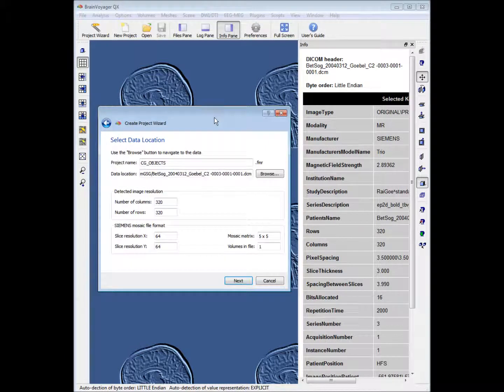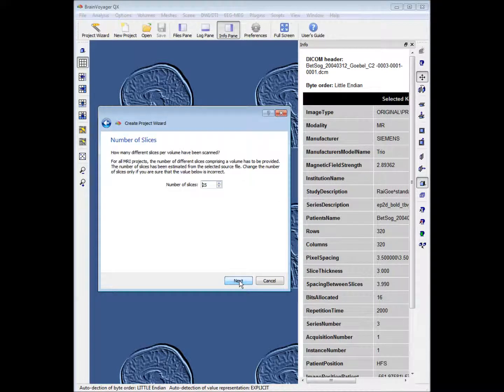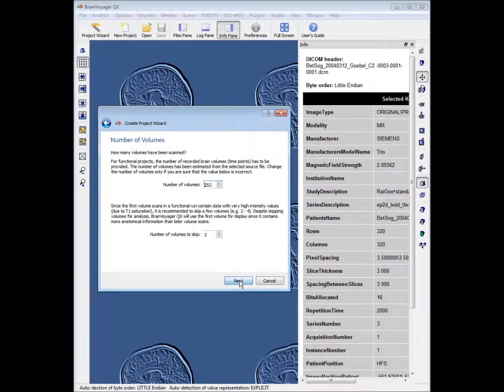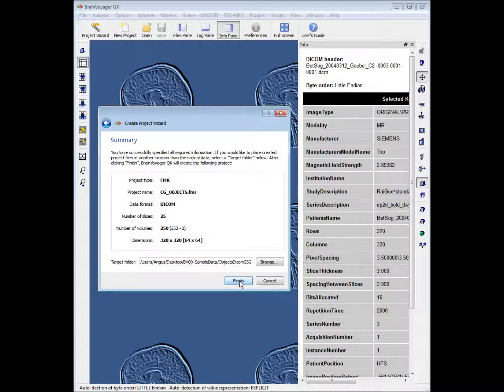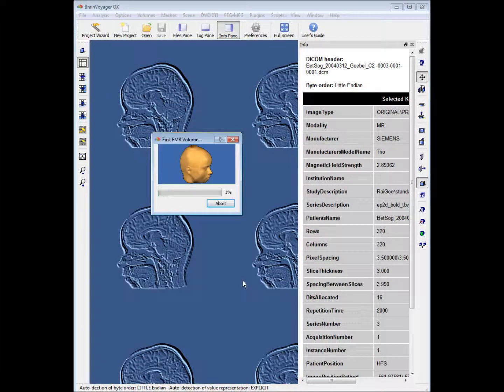BrainVoyager then pulls information about that run from the DICOM header file. We can ignore this for now and click Next. It has 25 slices — that's fine. We can ignore that and click Finish.